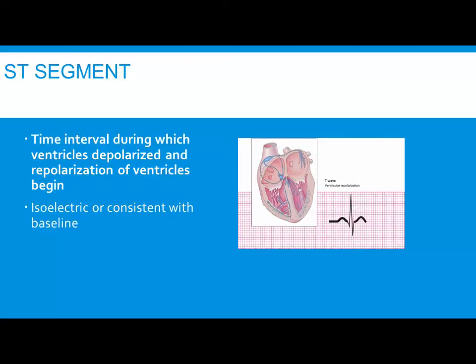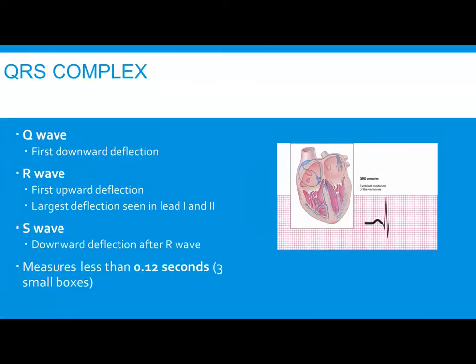All right? Are the measurements you're giving right now normal? Yes, it's less than 0.12. Miss Curry will probably tell you 0.08 to 0.12. I'm telling you anything less than 0.12. Because if you see a QRS, you're not going to see it get much lower than 0.08. That's going to be normal parameters.